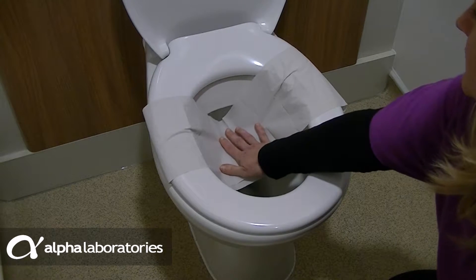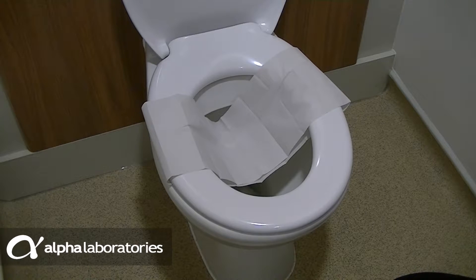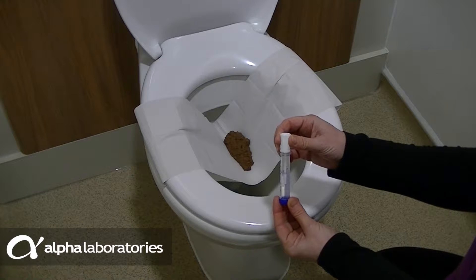Press down gently. Use the toilet as normal, ensuring the Fecol does not become wet. The paper is strong enough to hold the stool whilst you use the Calix to take the test sample.